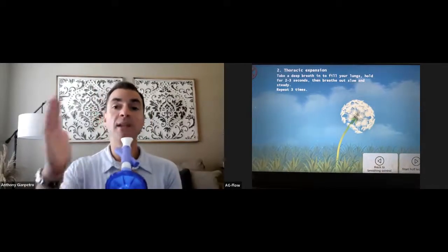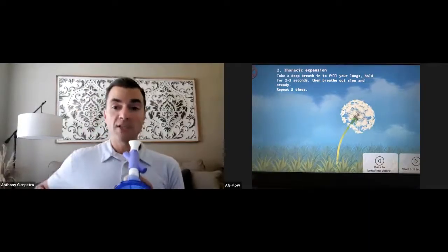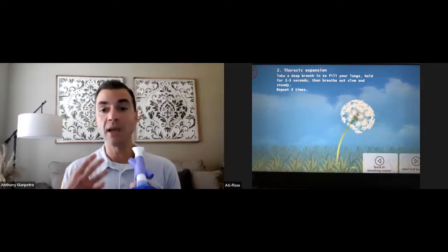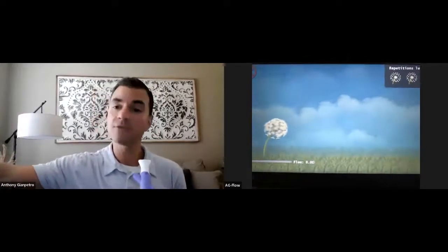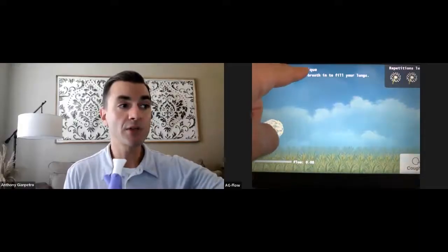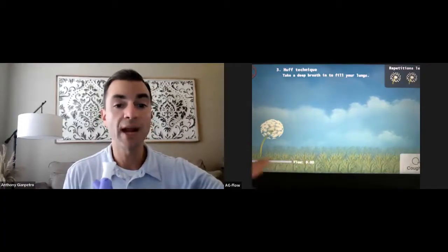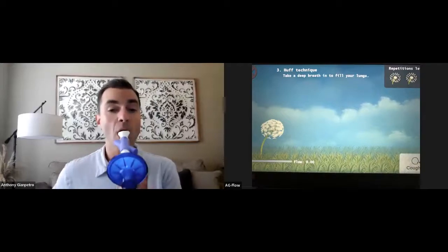So again, we're going to assume I did a couple of breaths, moving that dandelion left and right, trying to focus on my rib cage expanding laterally. And now I'm ready to do the huff technique, or blowing the dandelion seeds across the field so that I can clear my airway. So you'll notice that it says, please take a breath in to fill your lungs. Now, I do not have the inspiratory hold selected for this activity. So notice that all I have to do is make sure that I'm using the flow meter underneath the dandelion. So this is how it looks.